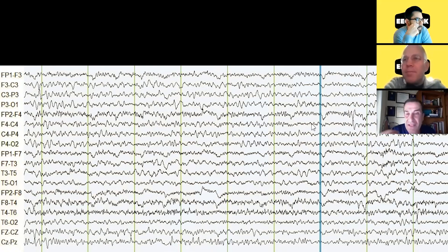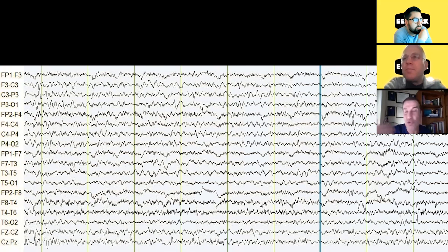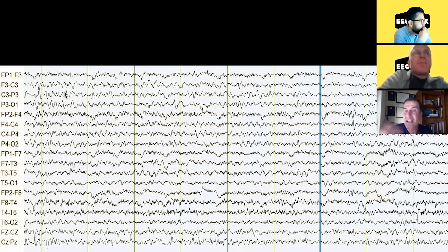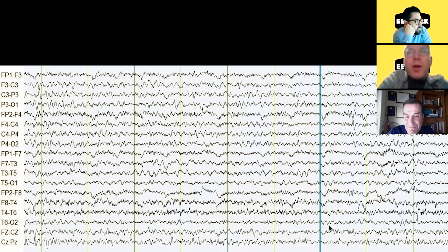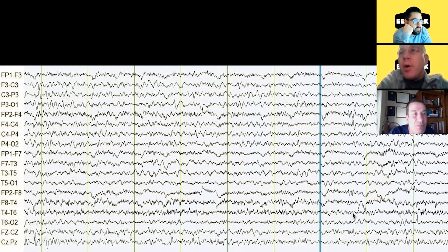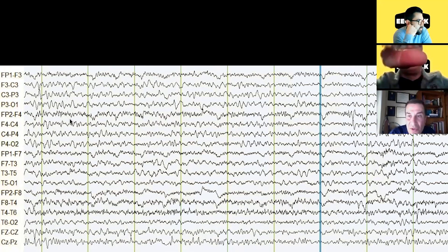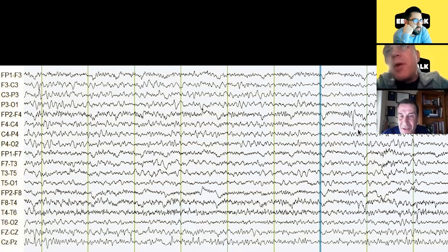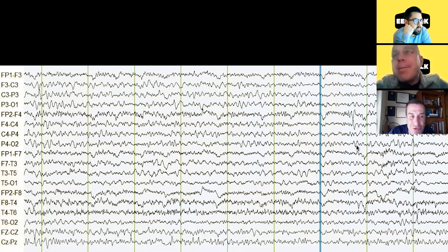It's relatively low amplitude and does not disrupt the background — it doesn't stand out. You want to see an after-going slow wave, and it should have a different frequency from the ongoing background. This one really does not stand out — it's the same frequency as the ongoing activity. What about the criterion of the upgoing and downgoing slopes being different? Probably not in this case, although the second downgoing part appears longer. The slope looks pretty similar — that is another criterion that can be helpful.